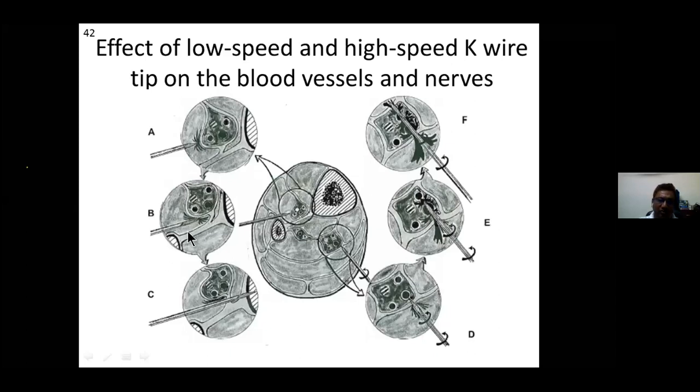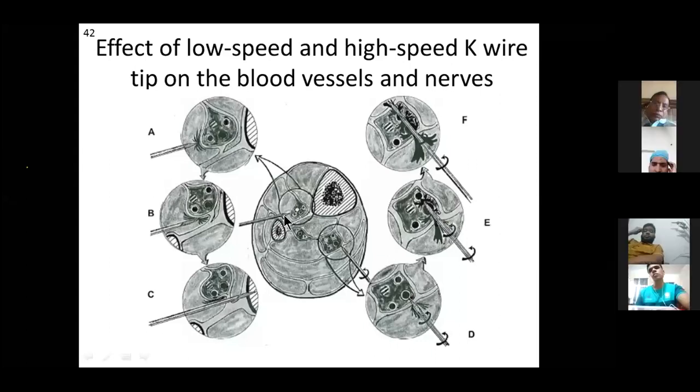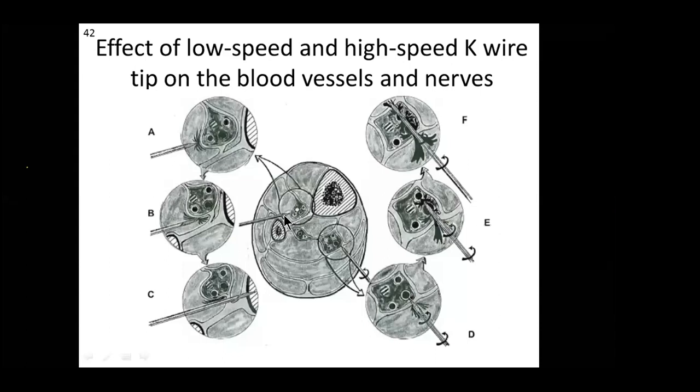And if it is slow, then the sheath will be displaced and it will be continued with the bone. So when you place the wire, you can place it with your hand and push it through the skin and slowly push up to the bone. When you feel the bone, then you will drive your power drill.